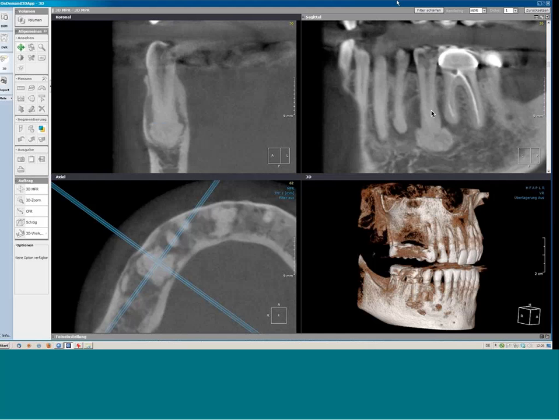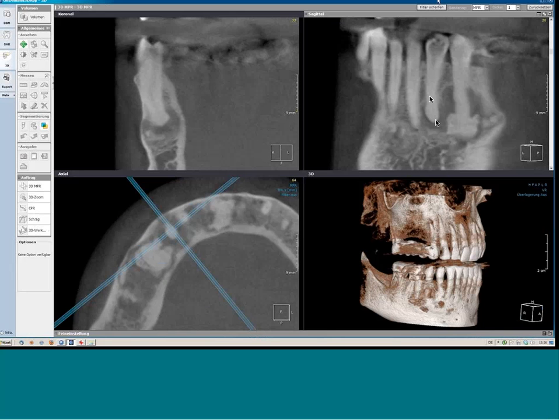But you can imagine that these kinds of changes in the bone are not really predictable with regard to their biomechanic characteristics. Here, the next two, you see a different stage in comparison to these two. So just remember that there are a lot of cemento-osseous changes, especially in the lower jaw.